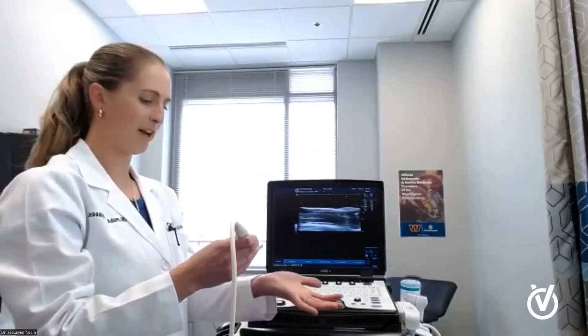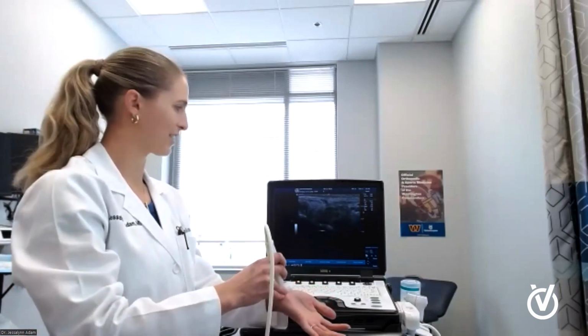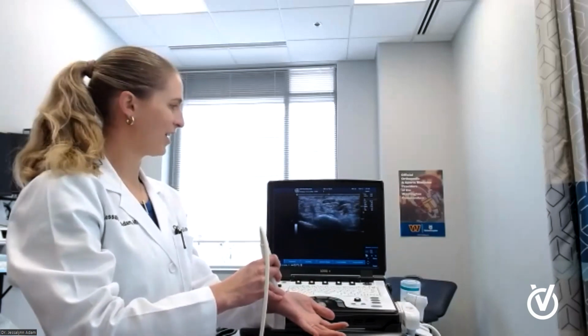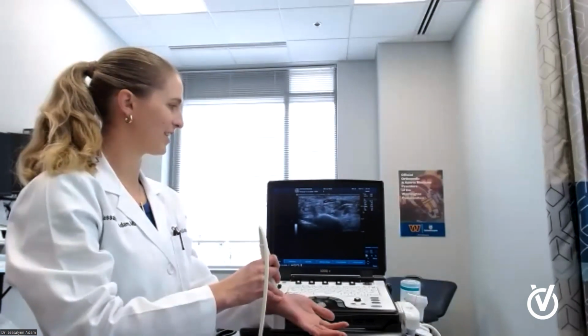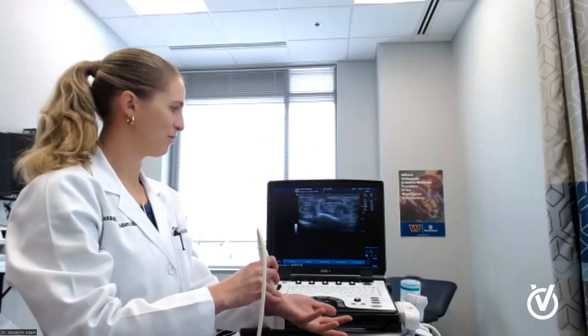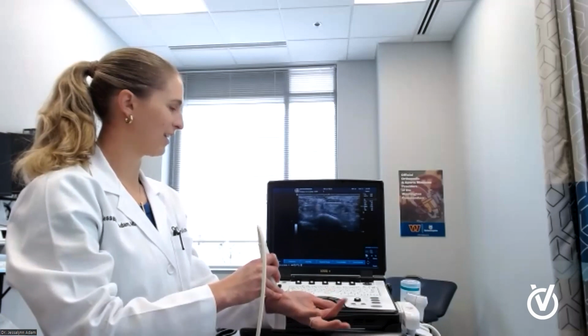So I'm going to start by evaluating my wrist here, and I'll point out a couple of things. So you can see that gray on the screen, and right in the center there is my nerve. So if you've ever heard of carpal tunnel syndrome, this is the nerve that's affected there. And I'm going to show you something really cool, which is that if I move my fingers here, you should see all of the tendons blinking.